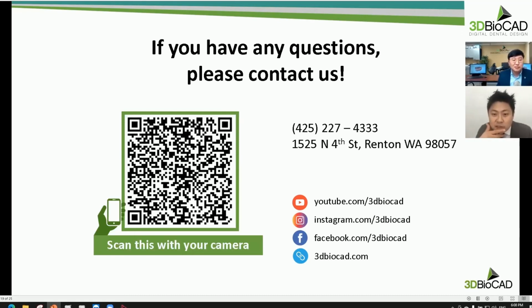Another question is about having a hard time relining the eggshell. Dr. Wan, the question is, sometimes dentists have a hard time relining the eggshell. What is your technique for proper reline technique? Maybe this video will go online on YouTube, so if you watch that, I'll go over the step-by-step of how I do this. Basically, I pick up the temporary abutment inside the mouth and fill out any voids and the emergence profile outside the mouth with flowable composite.